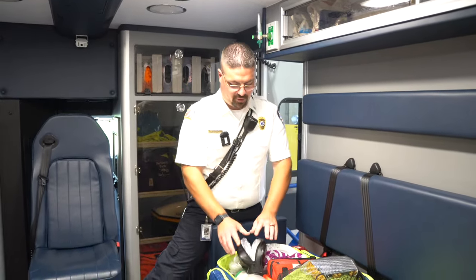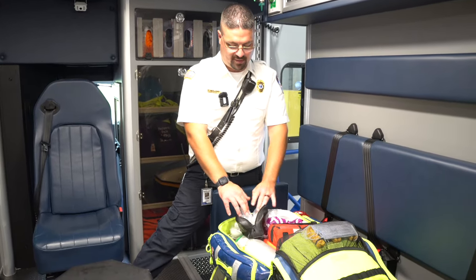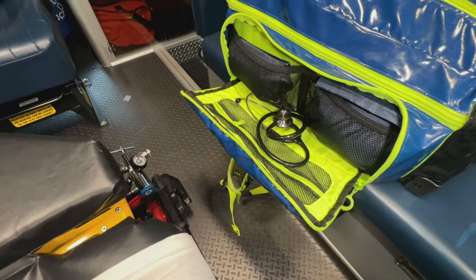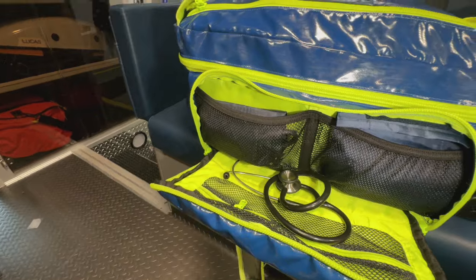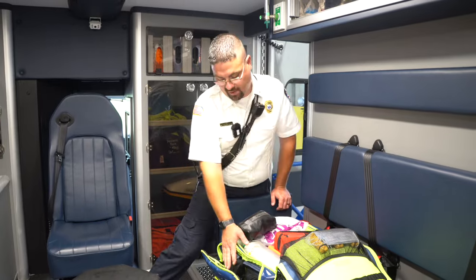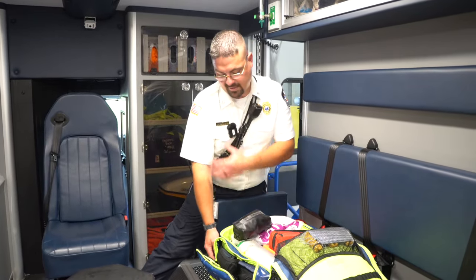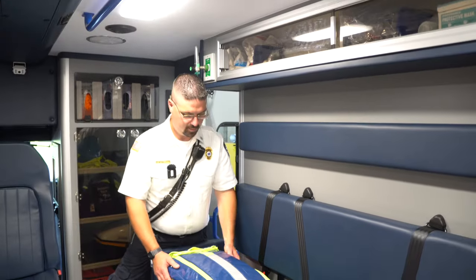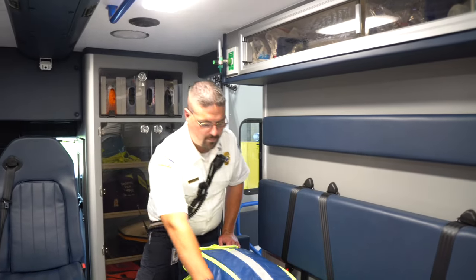For oxygen adjuncts — the oxygen mask and nebulizer setups are here. On this side we have blood pressure cuffs and a stethoscope for adults, with all pediatric sizes in the pediatric bag. We have adult and large adult sizes for people with a bigger bicep. That first-in bag can pretty much handle any emergency at that moment in time.